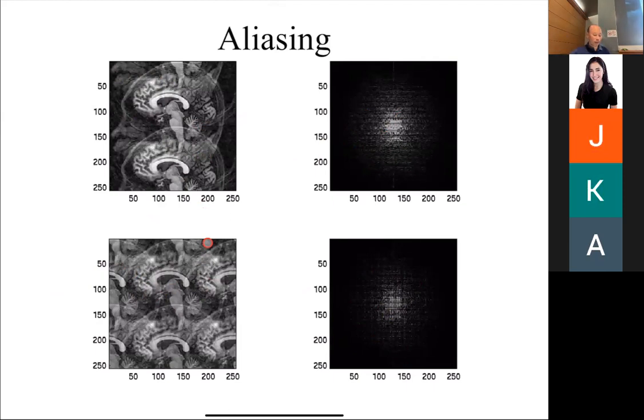For almost every MRI exam, we want to reduce aliasing. We're going to look at 2 ways of reducing aliasing. For this lecture, and probably some of the next lecture, we're going to talk about setting those parameters, delta K and WK, correctly. But that's like 40-year-old technology. What I'm teaching you now is 40 years old already, let's say. Then we're going to talk about what we actually do now to reduce aliasing.